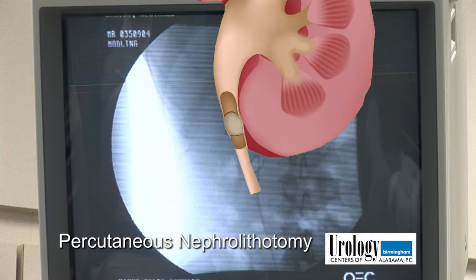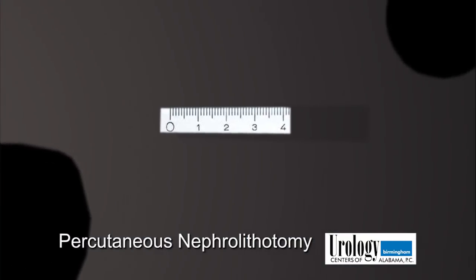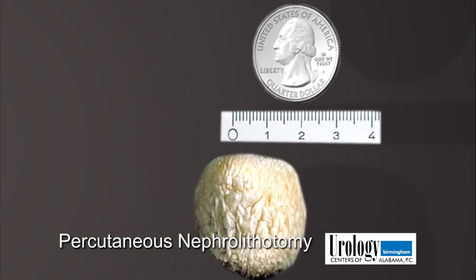He has a three centimeter stone in the right renal pelvis that we'll be doing the percutaneous procedure on today. You couldn't pass that stone and it's too big to do lithotripsy, where you break it and try to fragment it. It's much too large for that.